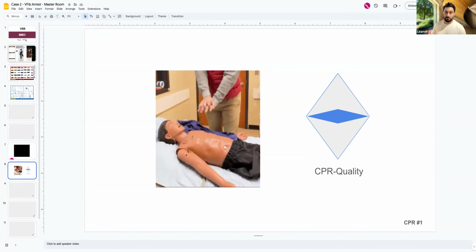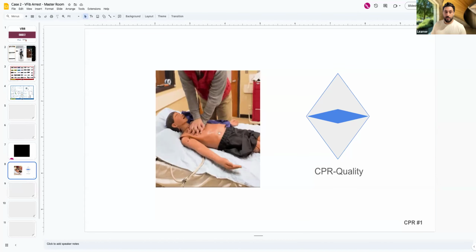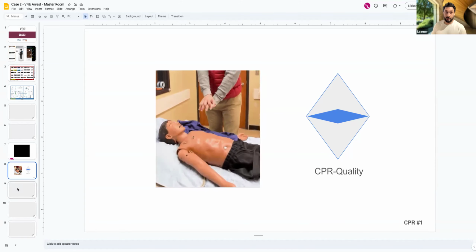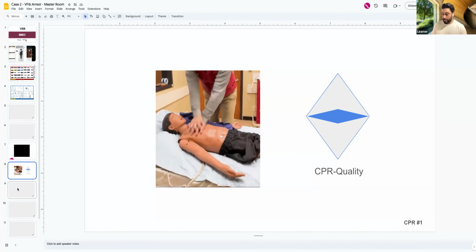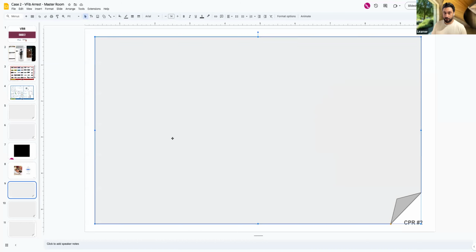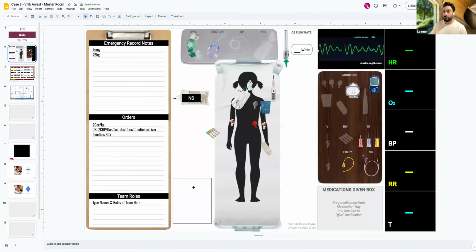Okay, so I can see your compressions. Can I get you to please compress at a faster rate, allowing for recoil in between? So I want you to compress at a rate of 100 to 120 compressions per minute. And then we'll be doing 15 compressions to 2 breaths. So these are your new compressions now. Okay, perfect. So improved. Great job, guys. And so as I said, can we get the CPR board and can we get pads attached as well?